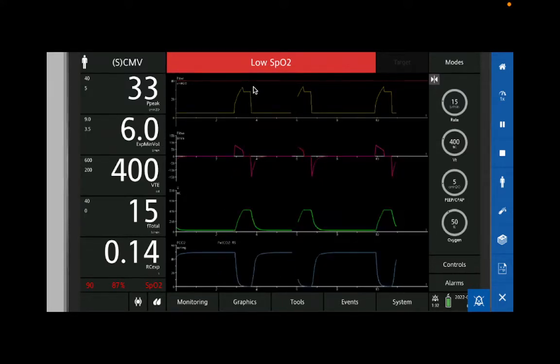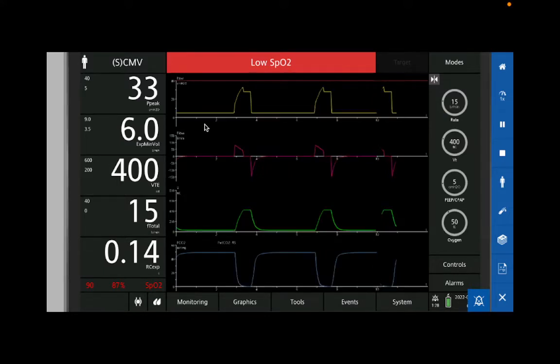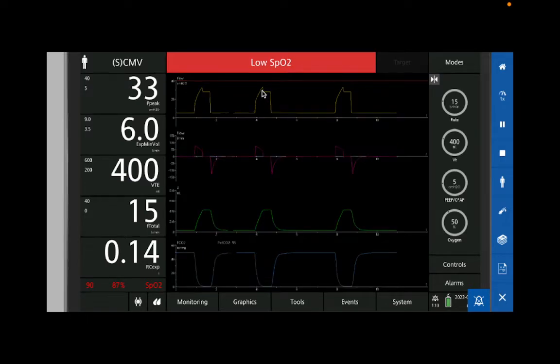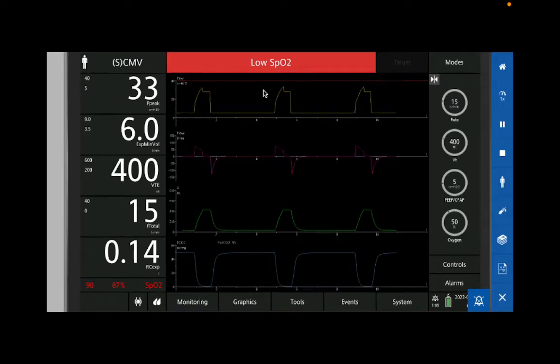The peak pressure is while the air is going through the lungs. First, it's always going to be higher because that air is moving. Moving air is turbulent and is going to create more pressure, okay? The other thing is anything that creates resistance to flow is going to make that pressure worse, okay? So I want you guys to picture the patient's endotracheal tube kinked, a little bit, not completely, but kinked a little bit so it's hard for the air to get in, okay?